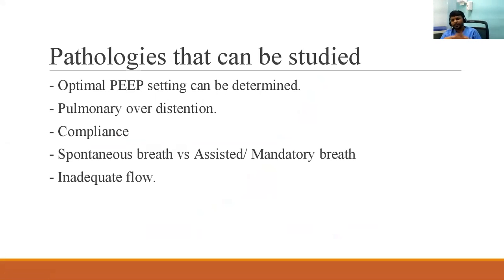It can also help us understand the nature of breath that is there in the baby, and sometimes when we are not giving enough flow rate in the ventilator, it will also tell us that the baby is actually struggling because of low flows.